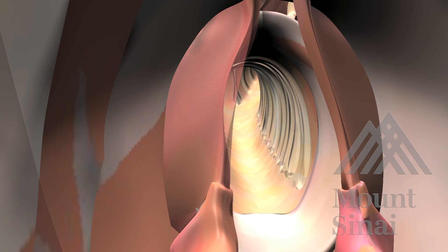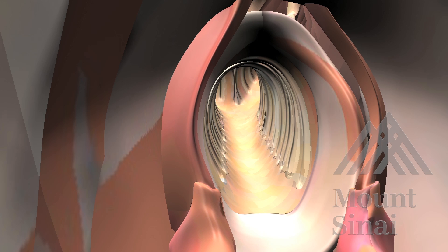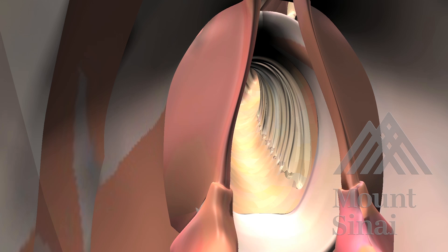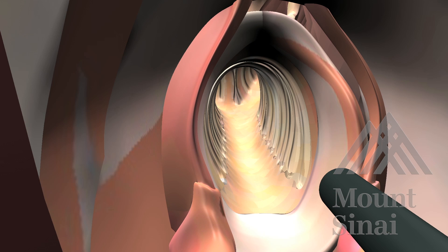We feel that vocal cord assessment is an important part of the pre-operative workup. Assessment of the vocal cords can be done using a flexible laryngoscope and can be performed in the office prior to the procedure or in the OR as seen here. First, spray the nasal passage with a local anesthetic, then insert the flexible laryngoscope to assess the vocal cords for bilateral mobility.